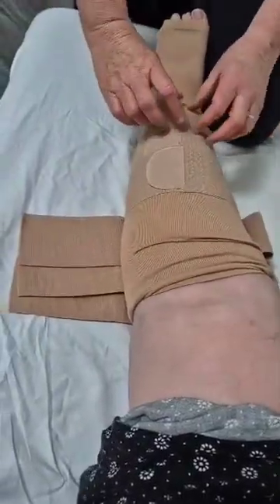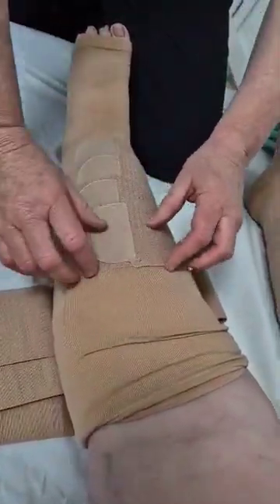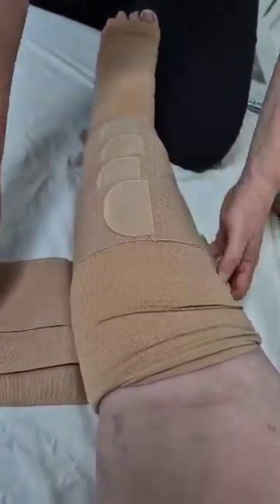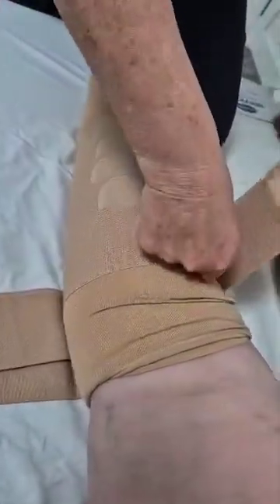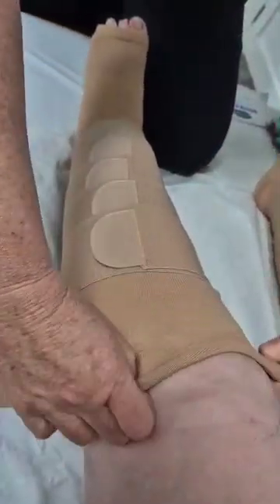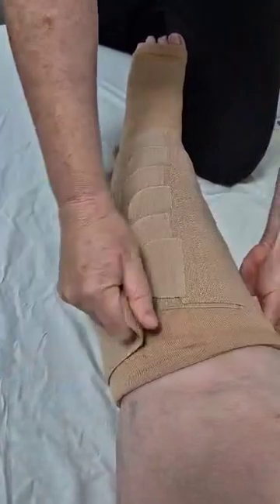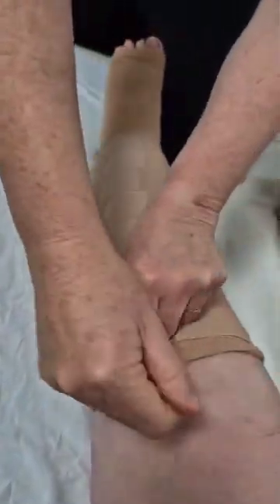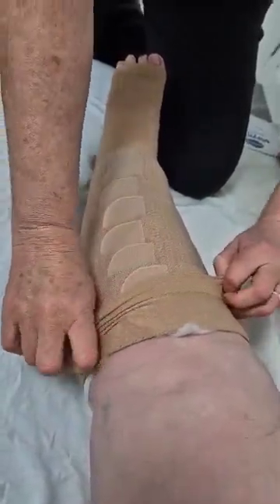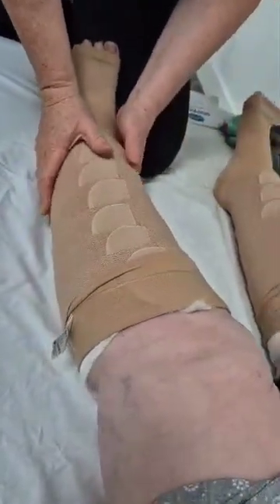Mm-hmm. Okay, now what we want is to have a nice parallel line, and each strap should overlap the one below it by about half. Pull, hold, connect. Pull, hold, connect. And then we can take this and just turn that over. But don't be afraid to get a pair of scissors and just give that a snip if it feels like it's too snug. Alrighty?